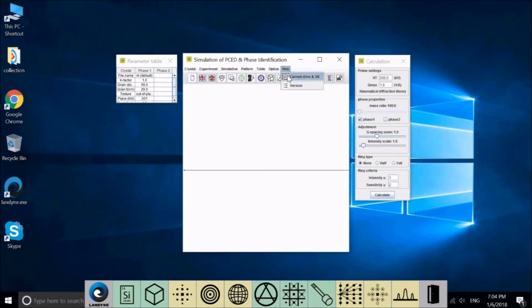In Help, you have the current drive and the serial number. We already introduced how to get a serial number in the previous video. It's very simple. You click here and you get this number here.